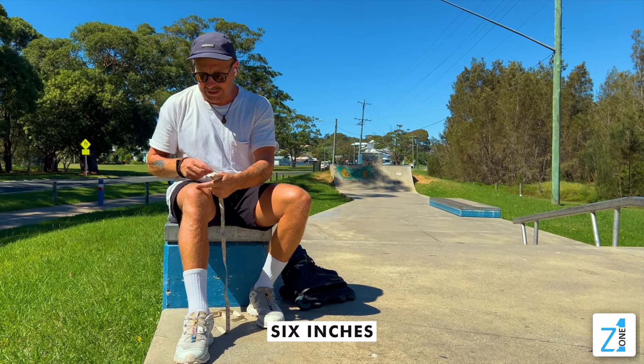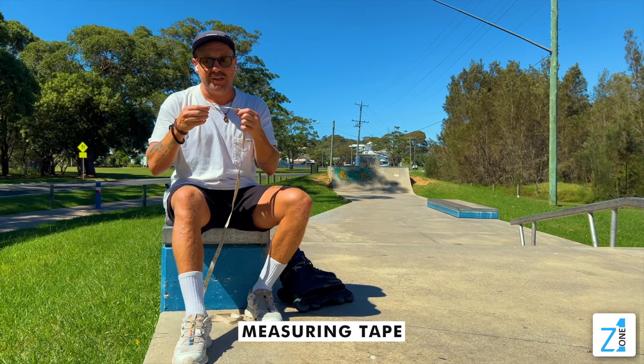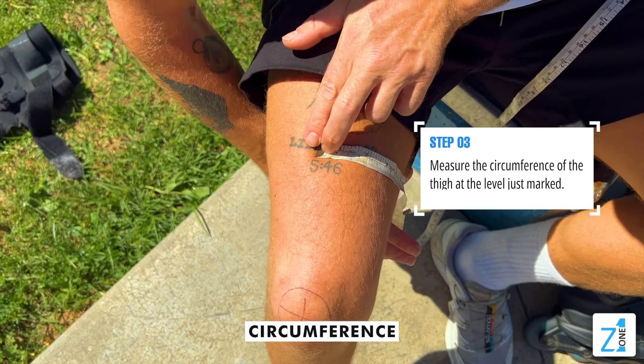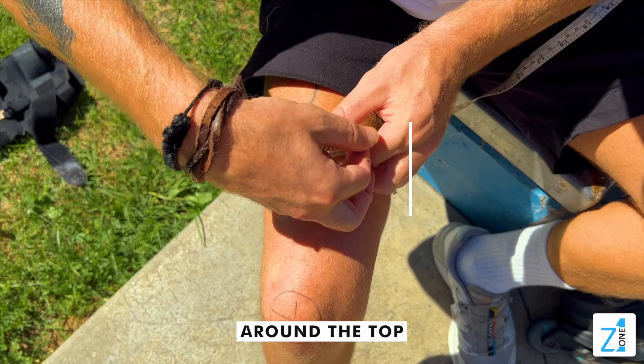Once you've marked six inches up on your thigh, grab your measuring tape and do a circumference measurement around the top of your thigh.